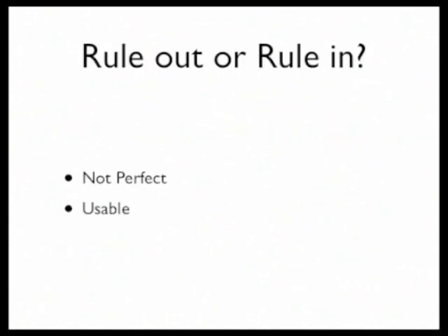So what are you going to do? You're going to use this to rule out torsion, rule it in? What do you think about this literature that we've kind of talked about? I don't think we have the literature to suggest that we're capable of ruling this out yet. And I'm personally not comfortable pulling the trigger on ruling out. I think ruling in makes sense.